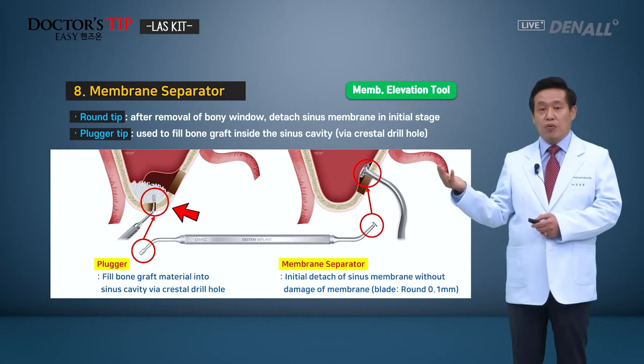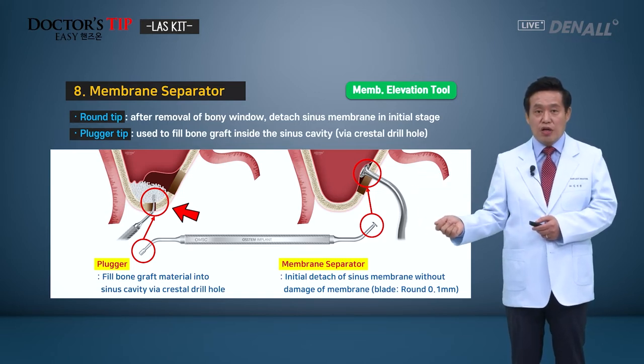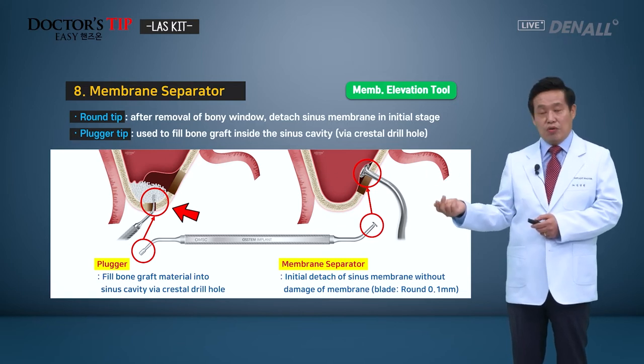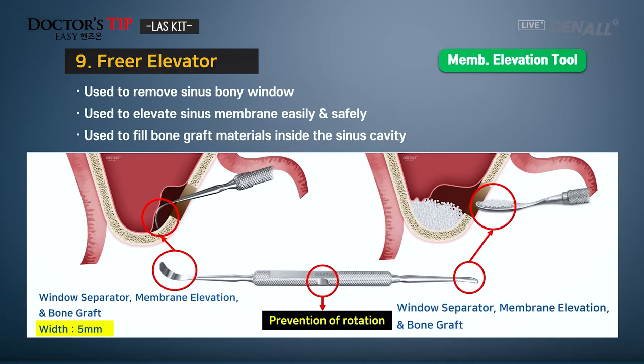And then you have this other side. This other side is used to fill bone graft inside the sinus cavity via a crestal drill hole. So as a plug, you can fill the material.